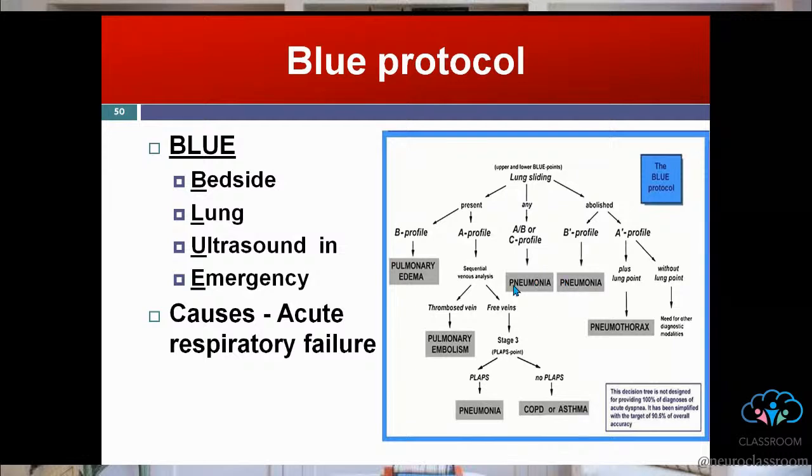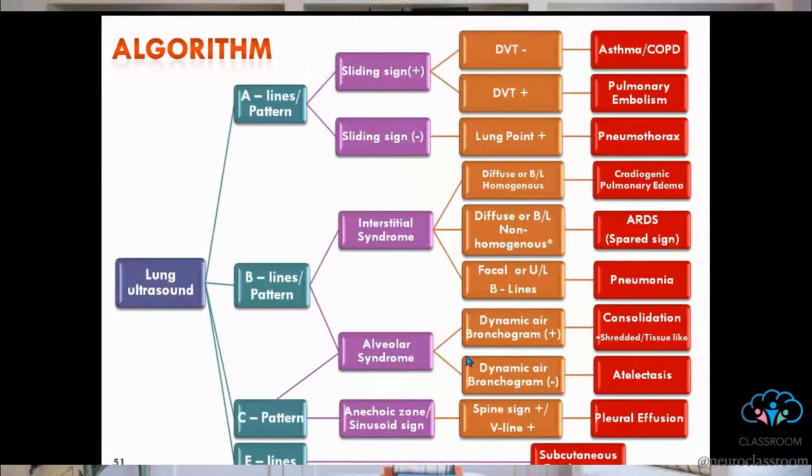The BLUE protocol is very famous all over the world. But somehow I'm not fond of this BLUE protocol, so I have struggled a lot, and I have devised a protocol for myself. If you like, you can also use this. This is a simple algorithm, which I have tried to make very simple. This is about the lung ultrasound algorithm.